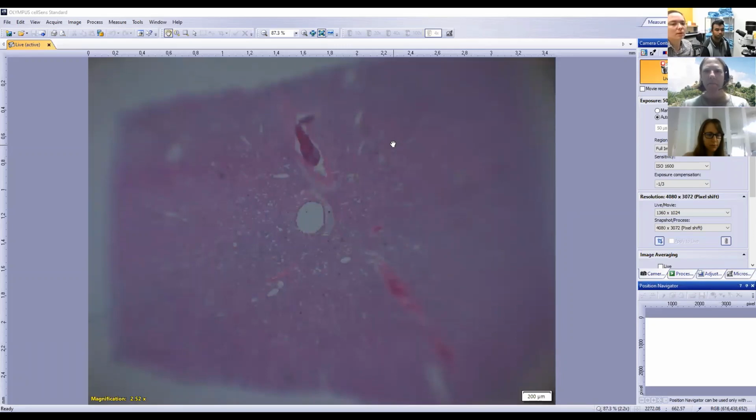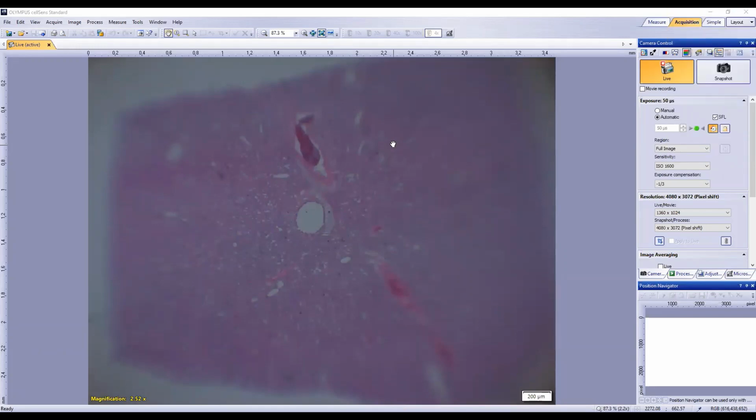Great. So starting off, what tissue? So this is a lung. I'd probably put a little bit of history on this. This is a lung from a horse, a 3-month-old thoroughbred with respiratory distress, non-responsive to treatment for 6 days. The gross pathology was a non-collapsed lung with rib impression. I'll not put anything more. Then we would go for the subgroups.